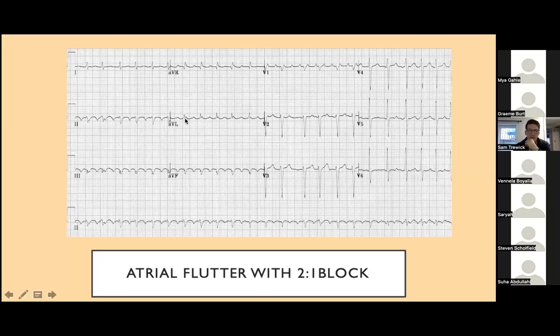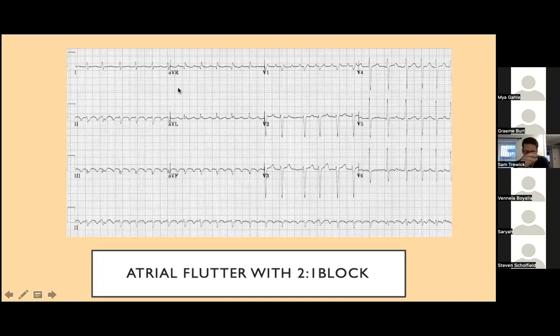I remember from medical school there was this sort of rule about the up and down in leads 1, 2, and 3. I always used to really struggle to remember exactly what was up, what was down. So I think about there's a circle that you have to remember when you're first learning about ECGs, the direction of the electrical potential, if you can remember and recall back to that, and you can remember and learn the values for that.